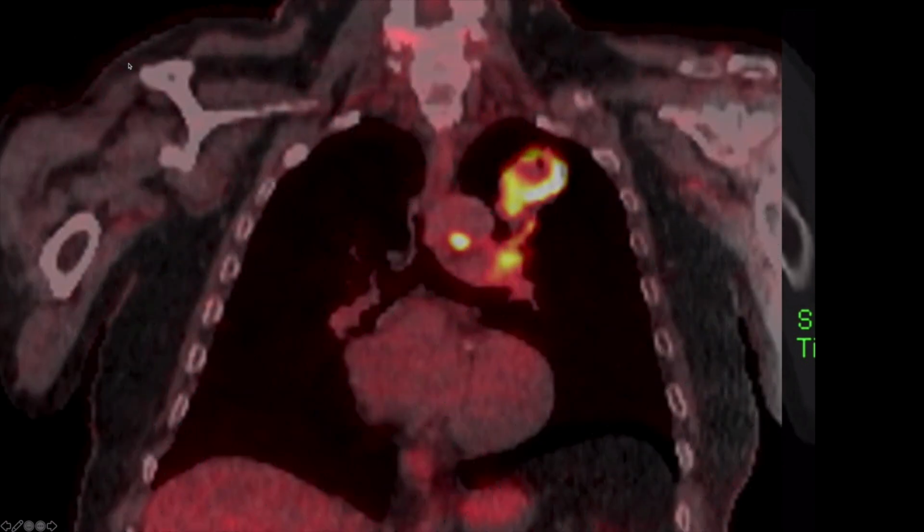So this is an FDG PET-CT scan. It is essentially a way of imaging sugar, because one of the things we know about cancer is it likes to eat a lot of sugar. So if we give a radioactive sugar, hopefully it will light up. And it's very important when it comes to staging, because the surgeon will want to know, are there any other sites of disease? If they only took out the lung cancer, and it turns out that there is a liver metastasis, that treatment may be quite futile and the patient might have benefited from more systemic treatment.